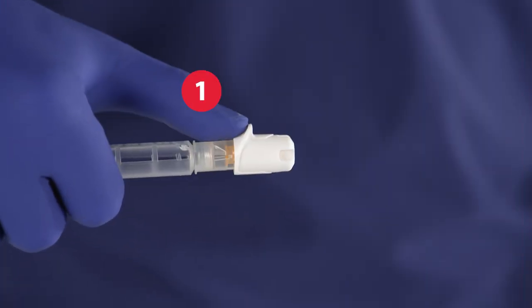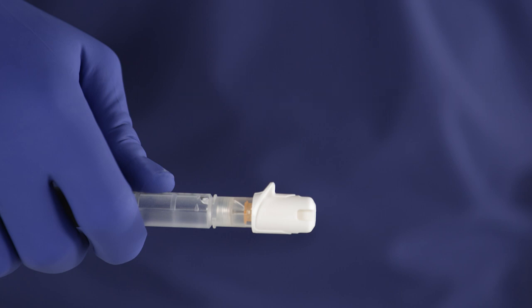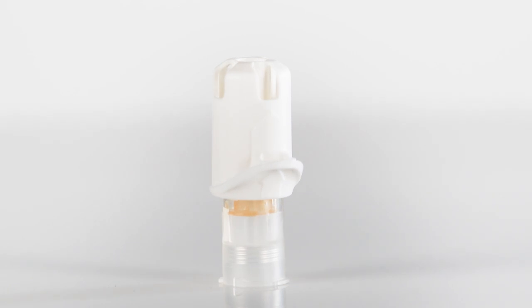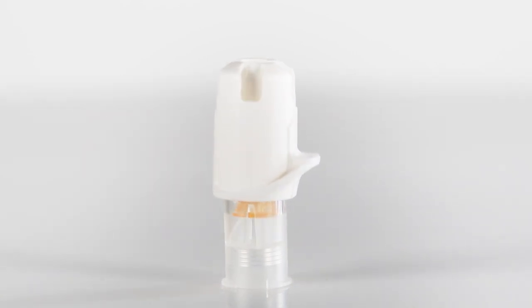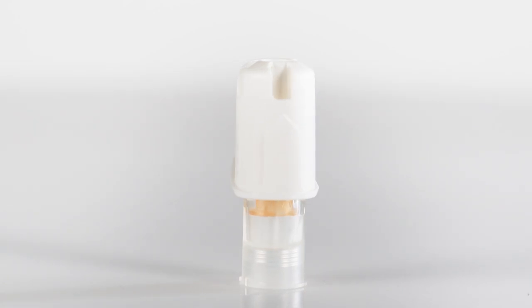Using one hand, push the manual tab on the safety guard towards the end of the needle until you hear a click, and the orange indicator is visible. After the safety mechanism is activated, both ends of the needle are covered. This helps protect you and your patient from needle stick injuries.